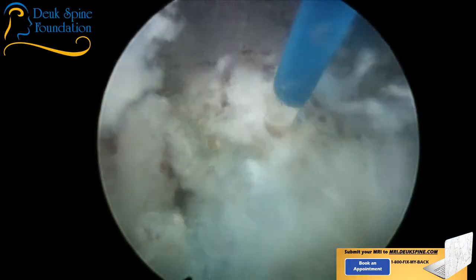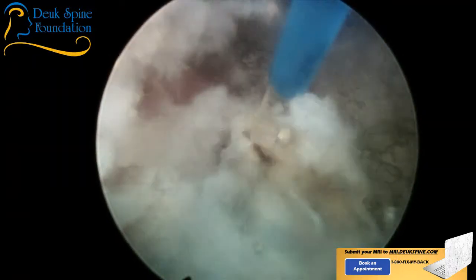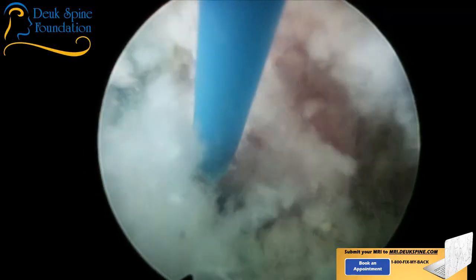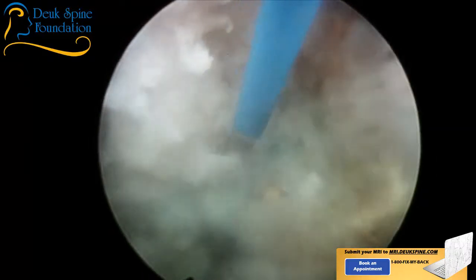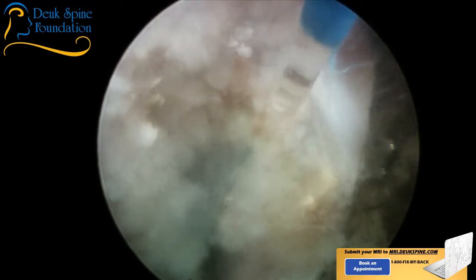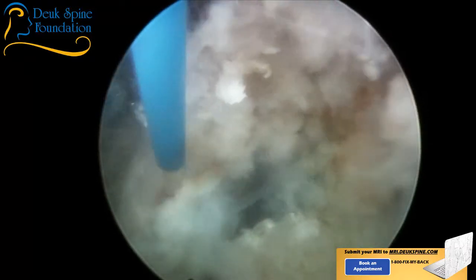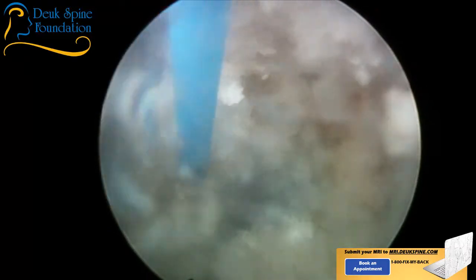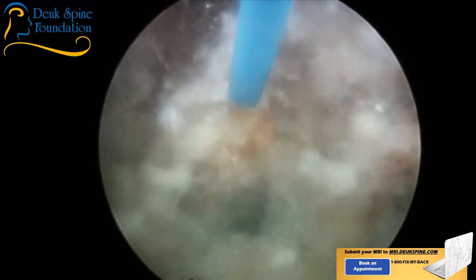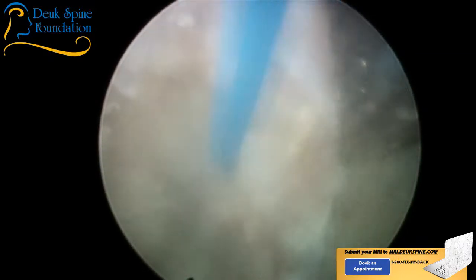Four minutes. Now why? Whew, all that, look at that, just crusty garbage. Sorry, not garbage like the kind of garbage you think of, but it's just all damaged disc. Severely damaged, severely inflamed. For years. This is not something that happened recently. You can tell by the structural changes that I'm seeing that this has been going on for a long time. This injury to the herniation, to the disc. Here's a bone spur.